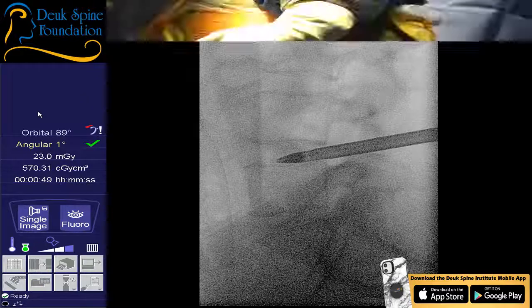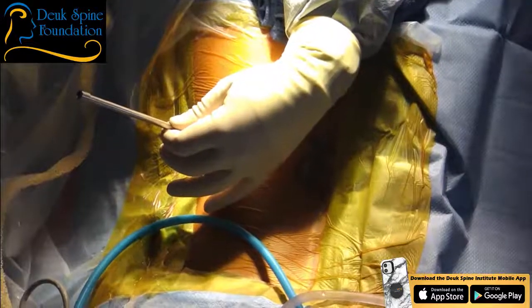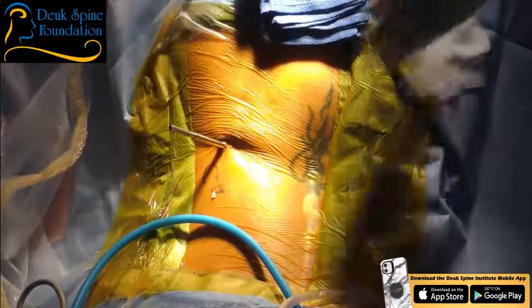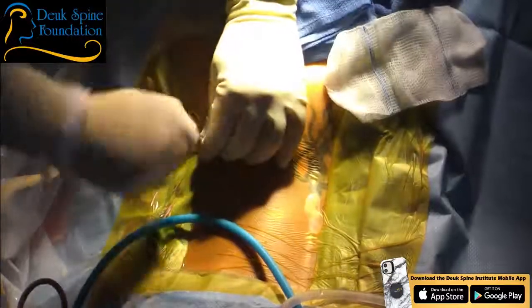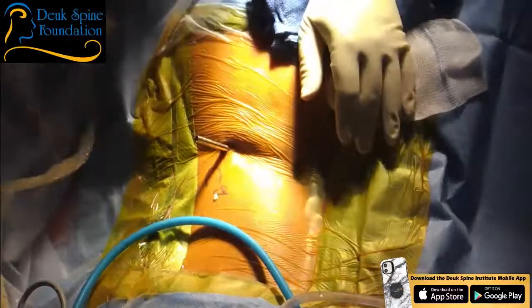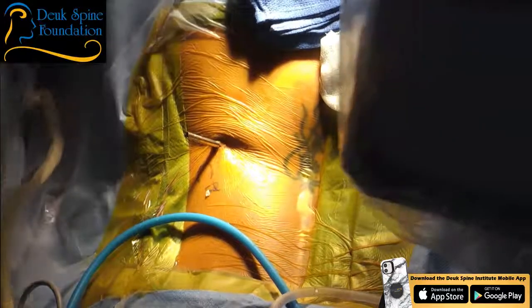All right, we're in. And we'll get this fluoro out, and we'll get the last disc done. That's L4-5. Any questions?